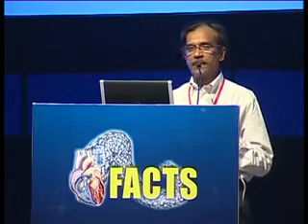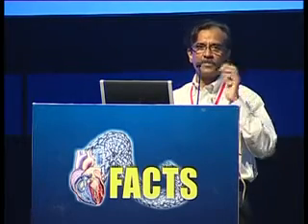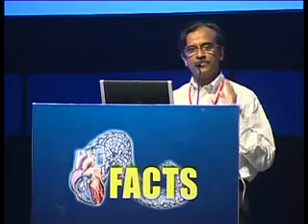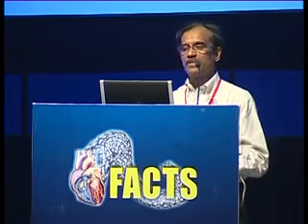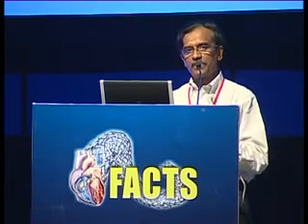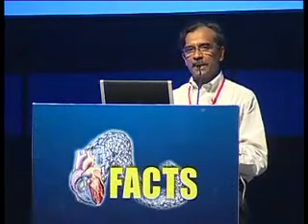If you place this catheter deeper, this will help so that when you advance the spring stylet, the catheter will not flip into the left atrial appendage. If you are not deep enough, when you advance the stylet, it flips into the left atrial appendage. So if you want to avoid the left atrial appendage, always position your catheter deeper in the LA cavity. At the same time, if you're deeper in the LA cavity, it is very unlikely that it will go into the pulmonary vein.